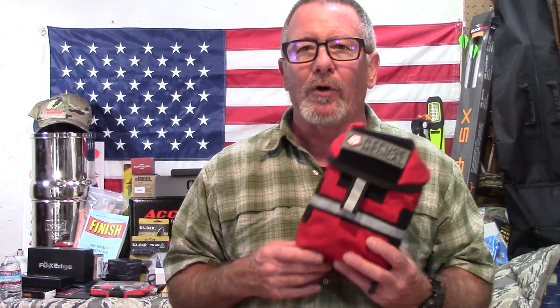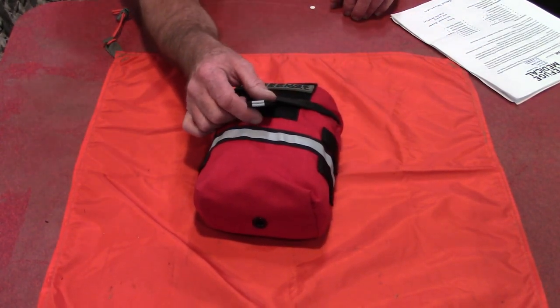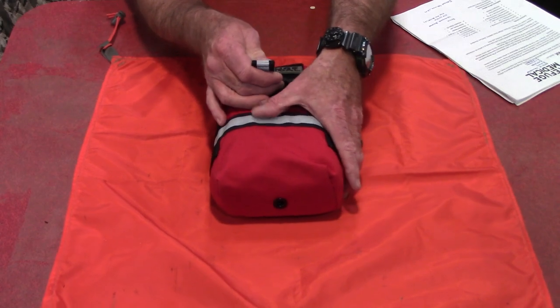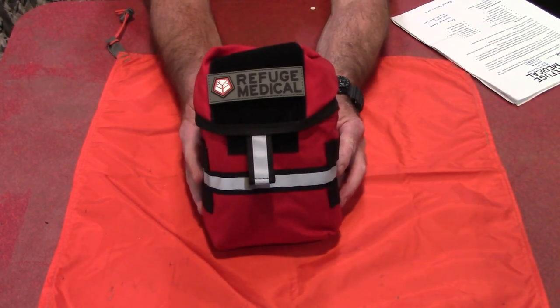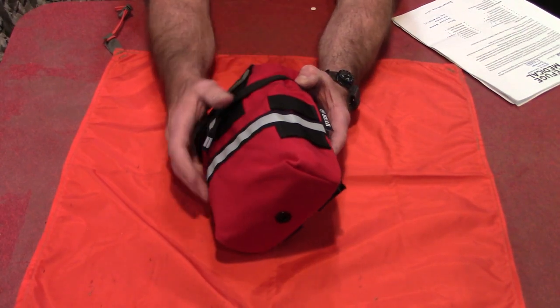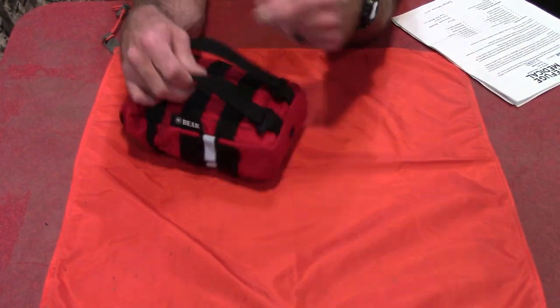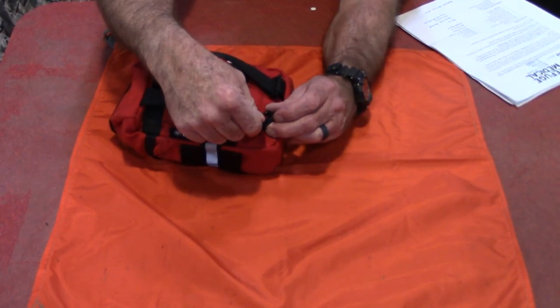Let's take a closer look at this kit. It is designed to cover the MARCH algorithm, which stands for Massive Hemorrhaging, Airways, Respiratory, Circulation, and Hypothermia — the five critical aspects of combat trauma. First, you can see this comes in a nice red pack. It has a reflective strip, MOLLE-compatible straps with a nice catch so you can attach it to your MOLLE system. It's also available in black, Coyote Tan, red, gray, OD Green, Ranger Green, MARPAT, Multicam, and Woodland — nine different colors.